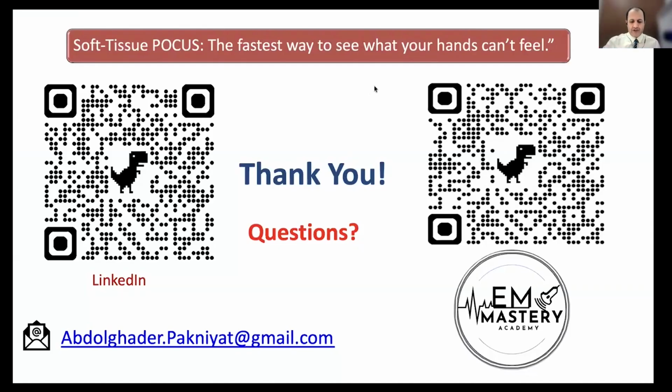Actually, we don't use elastography in detecting foreign bodies. In a foreign body, we are looking to find an object below the skin. So per my knowledge, there is no role to do elastography to detect a foreign body, and as I know, there is no use for that.